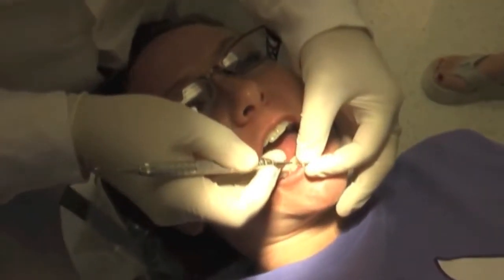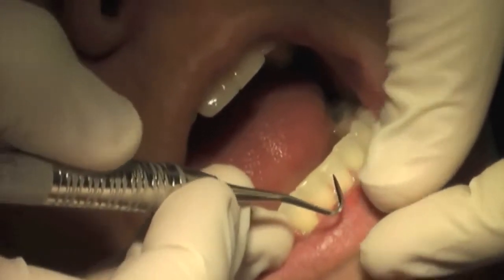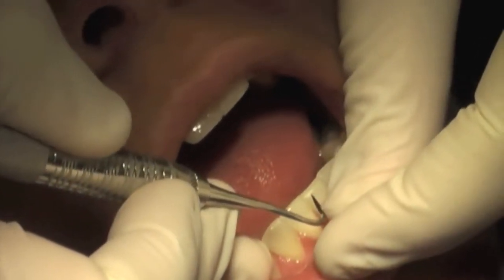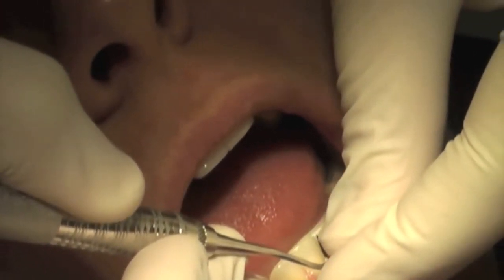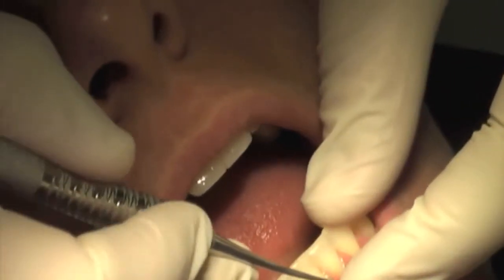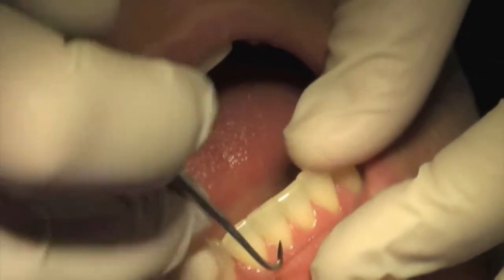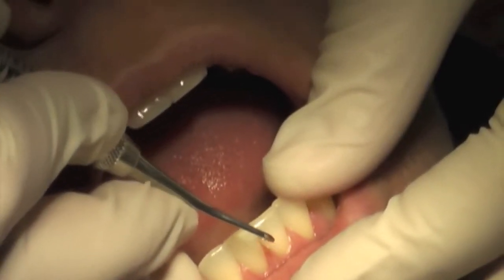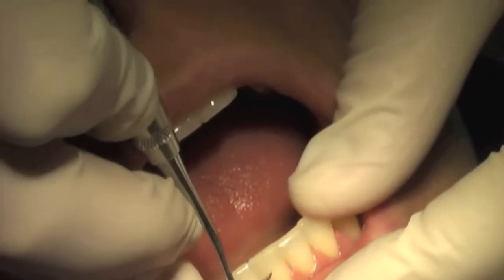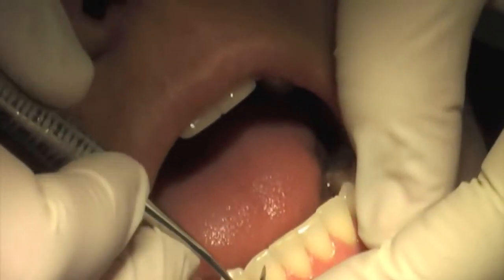Today we're going to do adaptation, angulation, and activation. Adaptation has to do with keeping the toe third of your instrument in direct contact with the tooth. Most of the time when I work with new students, they're worried more about the middle part of the toe of the instrument. Really, all that you're using is the toe third — just that much. When you go to work with your instrument, you only use the toe, and I'm going to keep that toe in constant contact with the enamel of that tooth. See how I do that? I just keep that toe constantly, constantly connected to it.